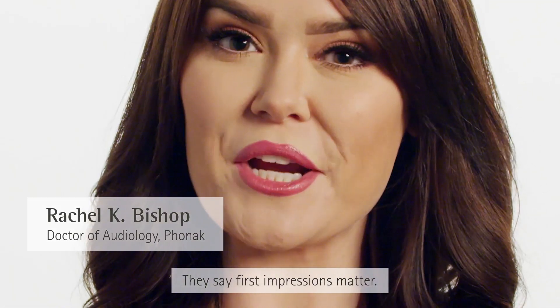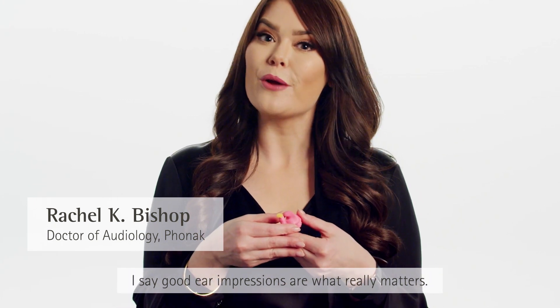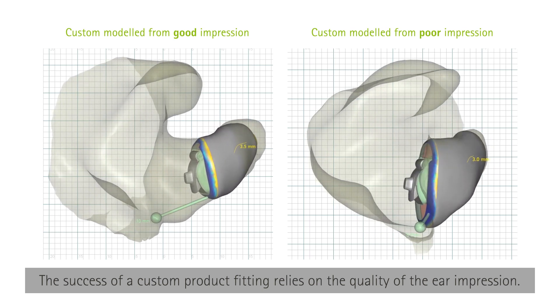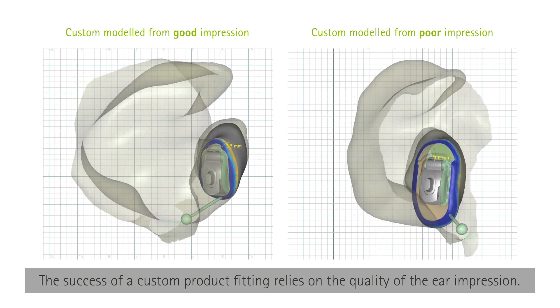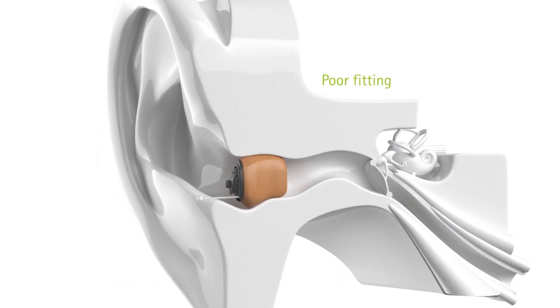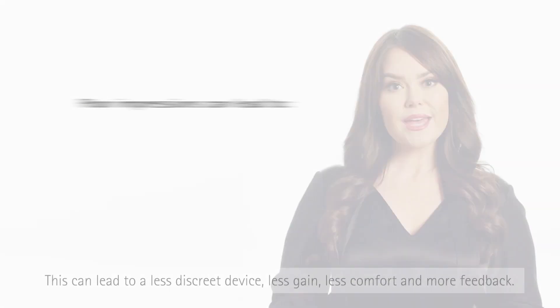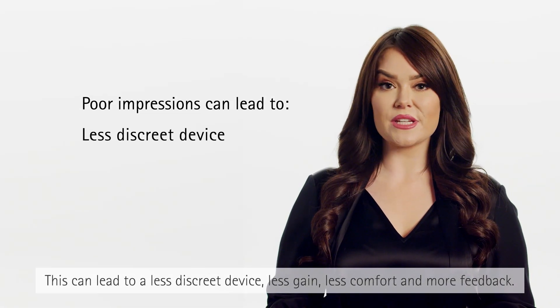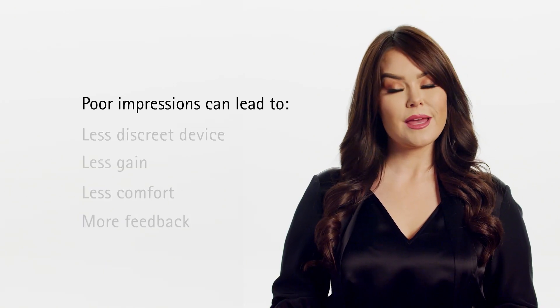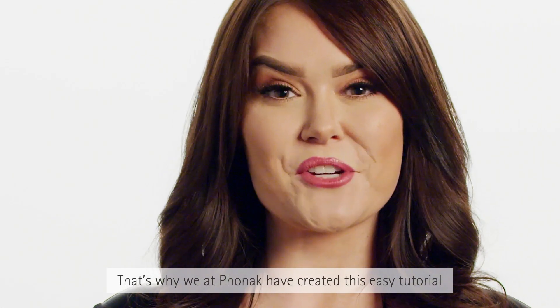They say first impressions matter — I say good ear impressions are what really matters. The success of a custom product fitting relies on the quality of the ear impression. A poor impression can result in insufficient acoustic seal and the custom product not sitting deep enough in the ear canal, leading to a less discreet device, less gain, less comfort, and more feedback. That is a recipe for an unhappy client.